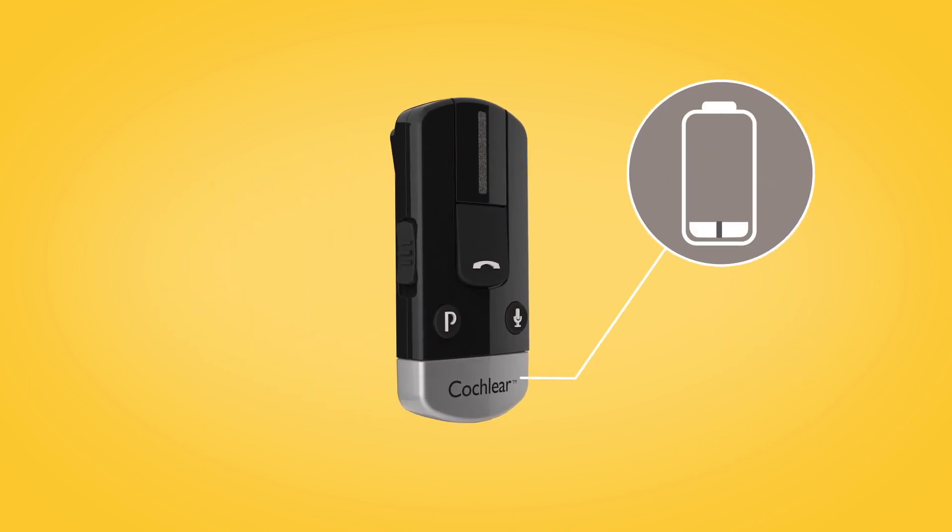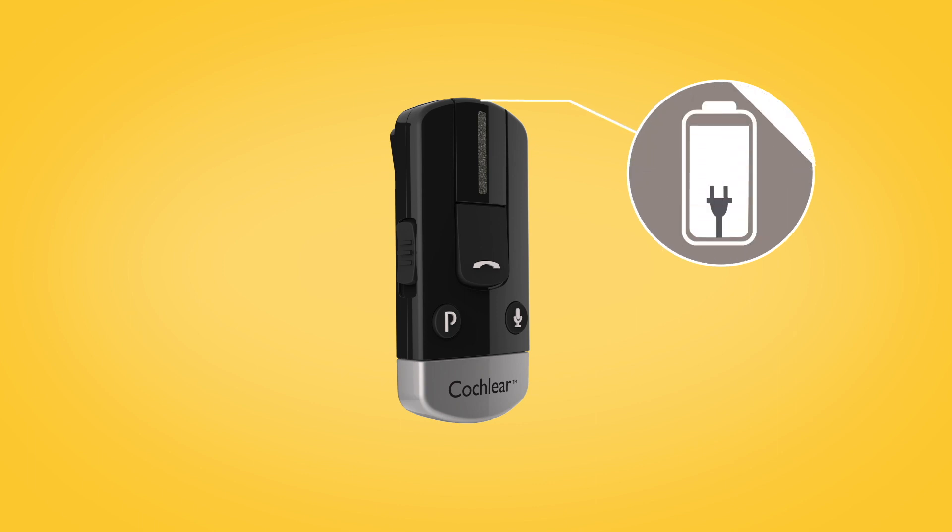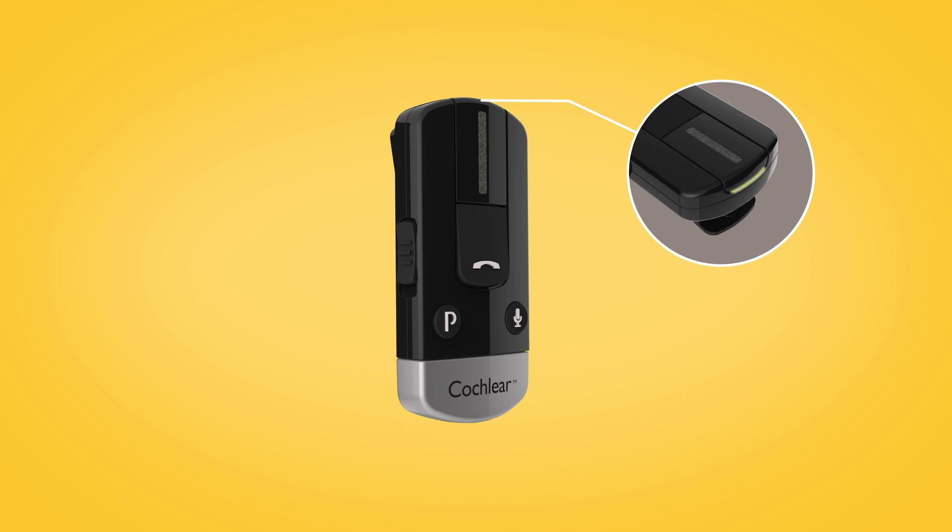While charging, the LED on top of the foam clip lights red. When fully charged, it lights green, with red flashes every two seconds.